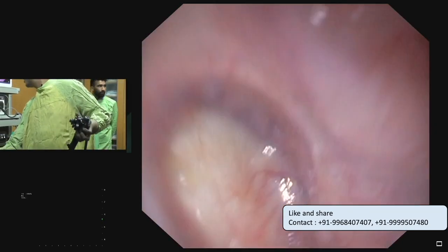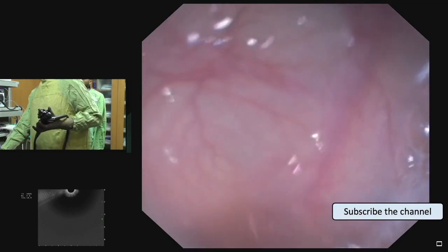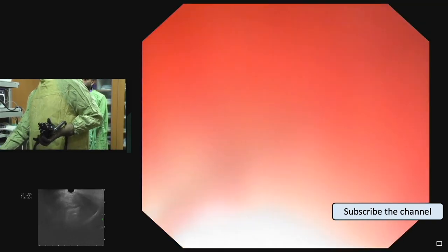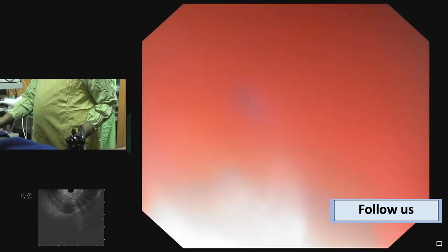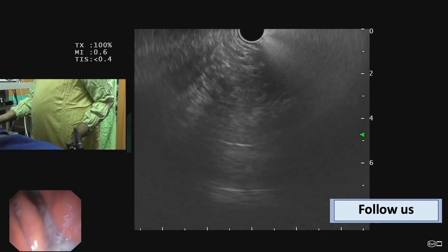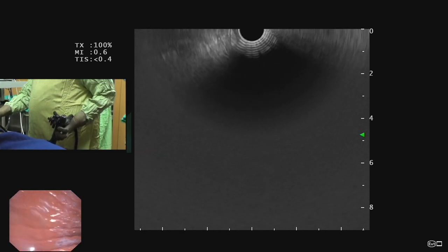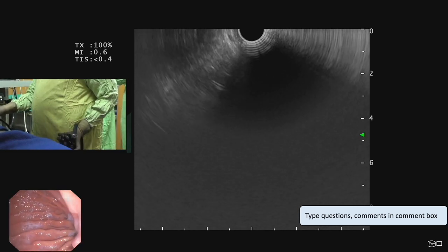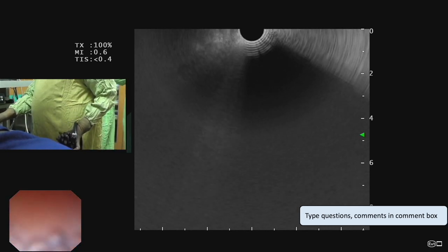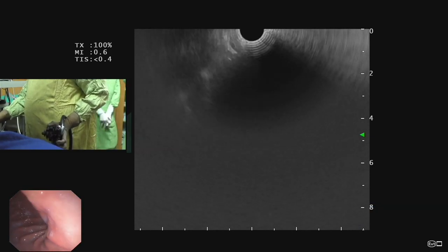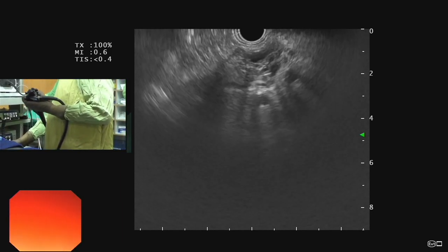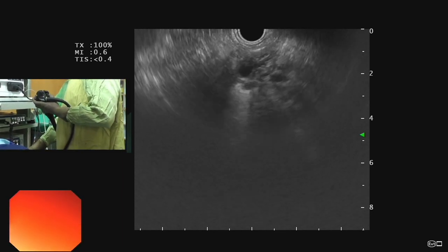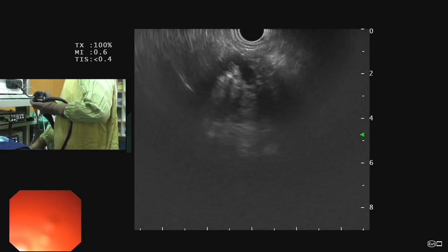In this patient we will focus on imaging of the pancreatic duct. We will explain a simple method to focus directly on the pancreas. First we enter inside the stomach — our scope is in the proximal stomach. On the left side of the endoscopic image is the greater curve, on the right side is the lesser curve. Anteriorly is the anterior wall, posteriorly the posterior wall. Pancreas lies close to that angle and is posterior to the posterior gastric wall. Near that angle, if we rotate the scope clockwise through the posterior gastric wall, we can see the pancreas — here with a dilated duct.